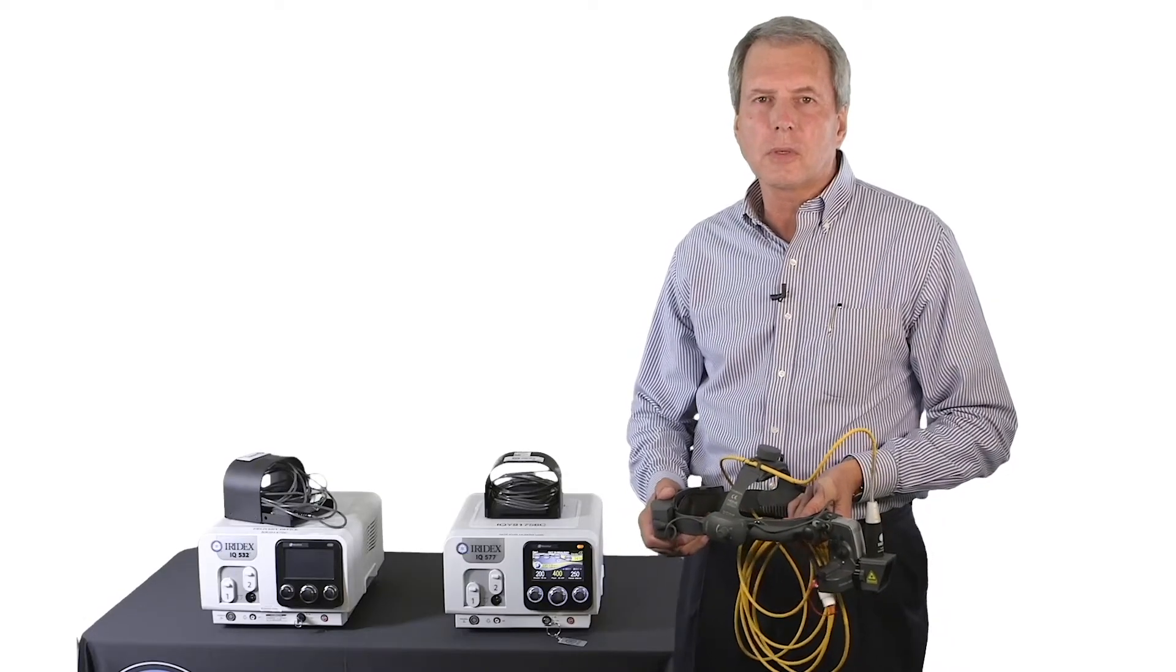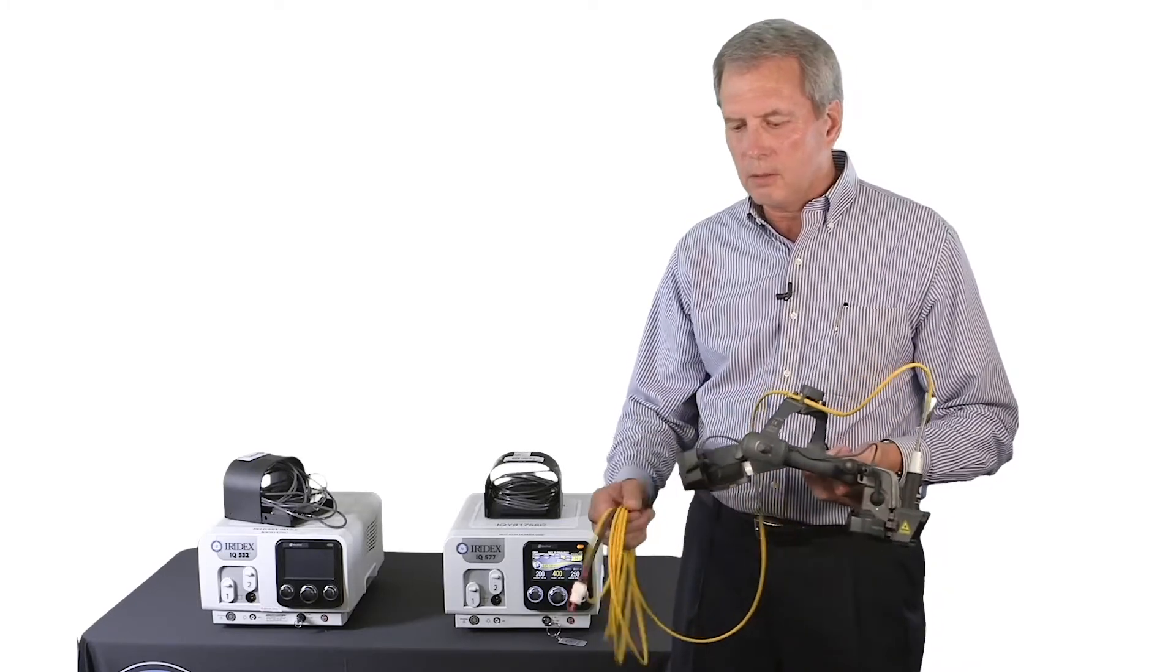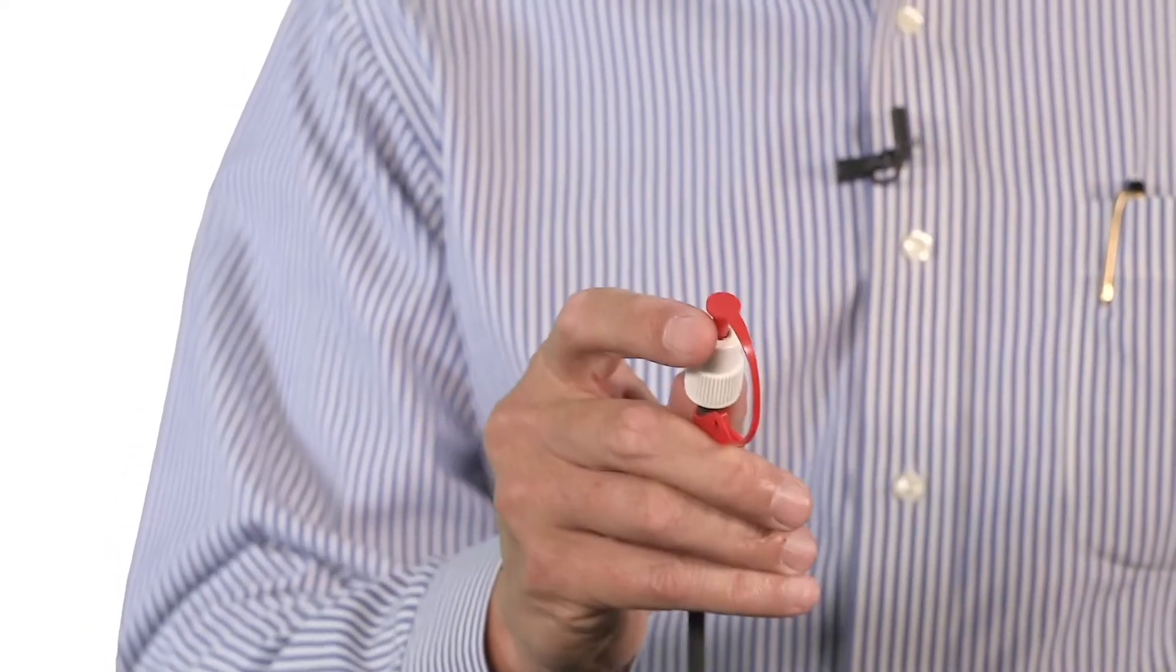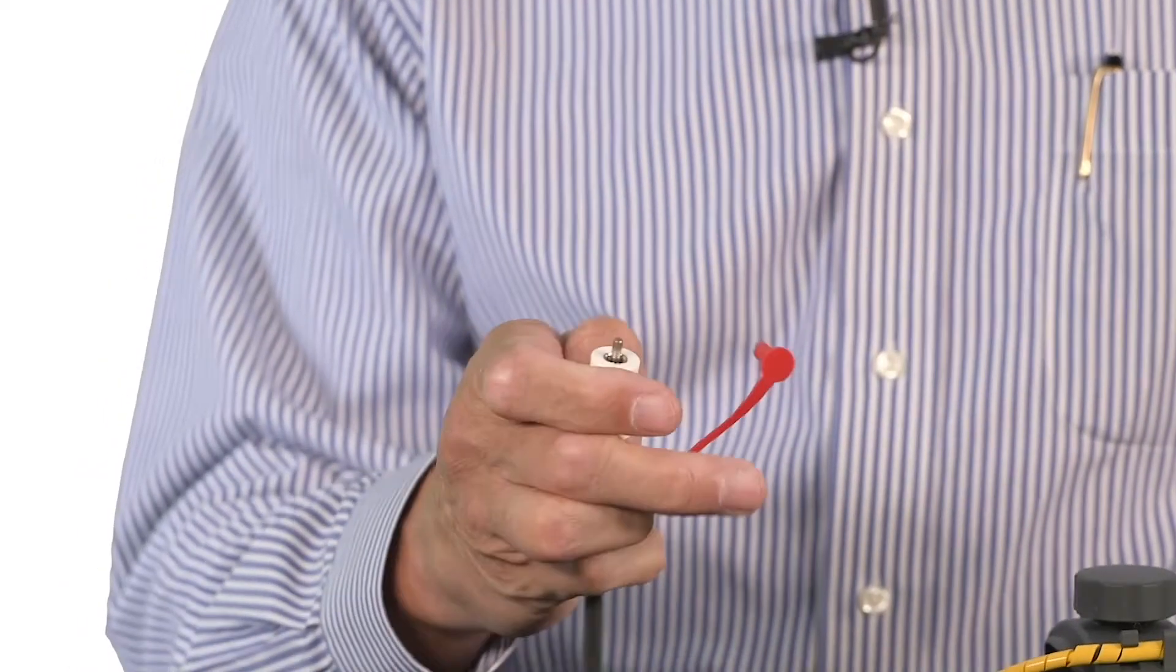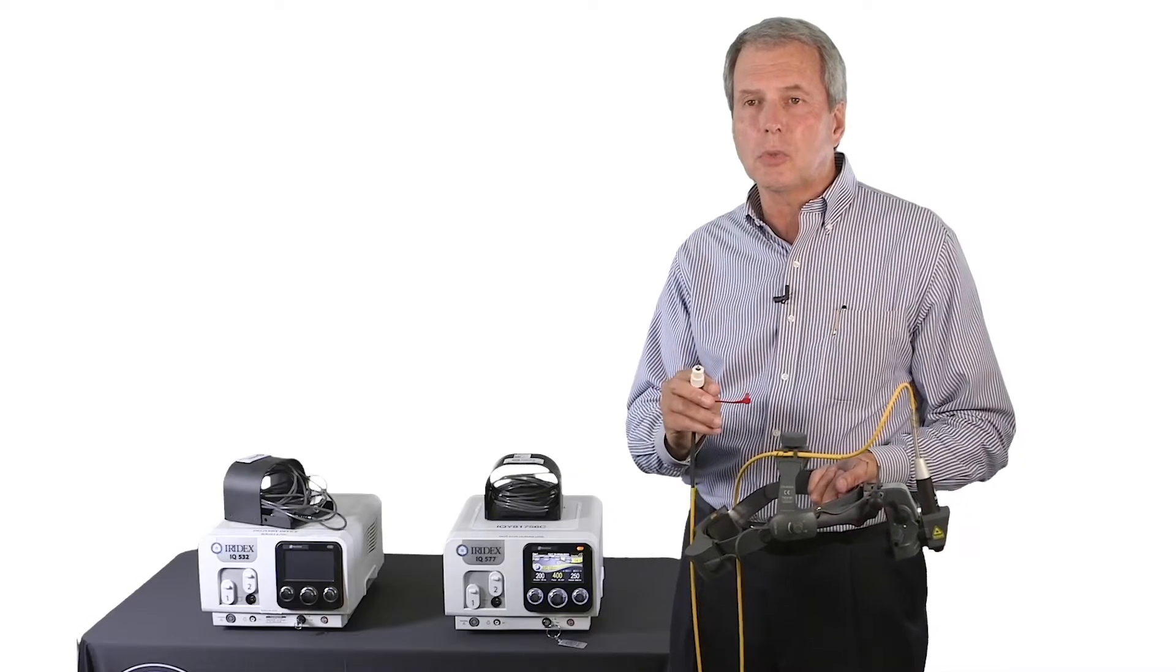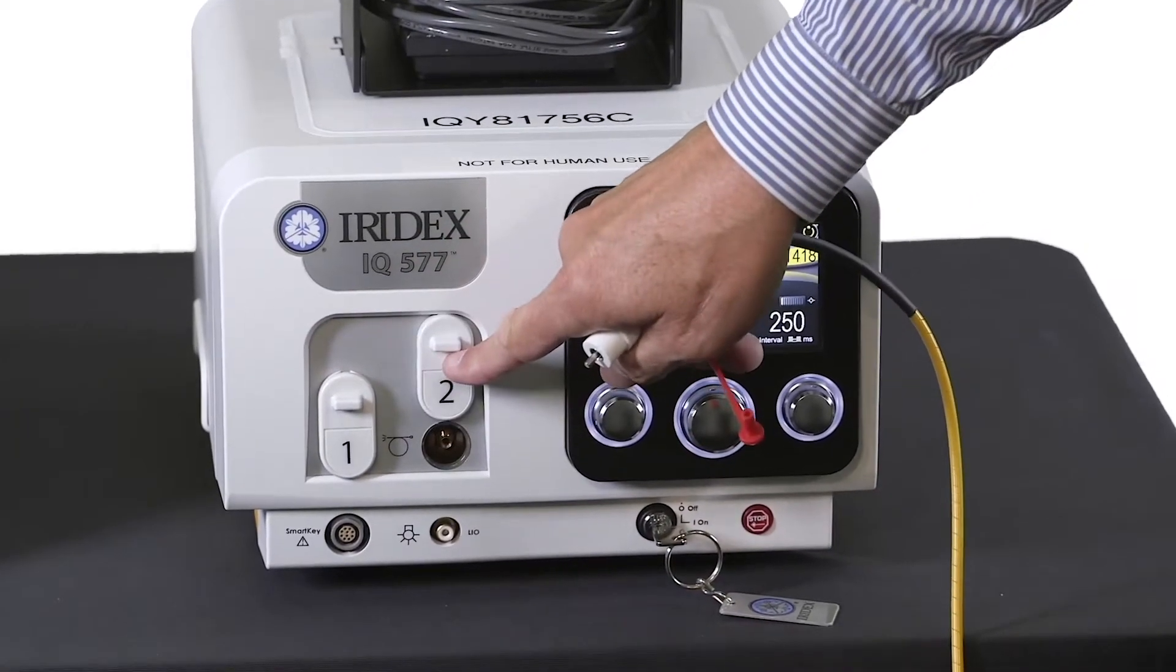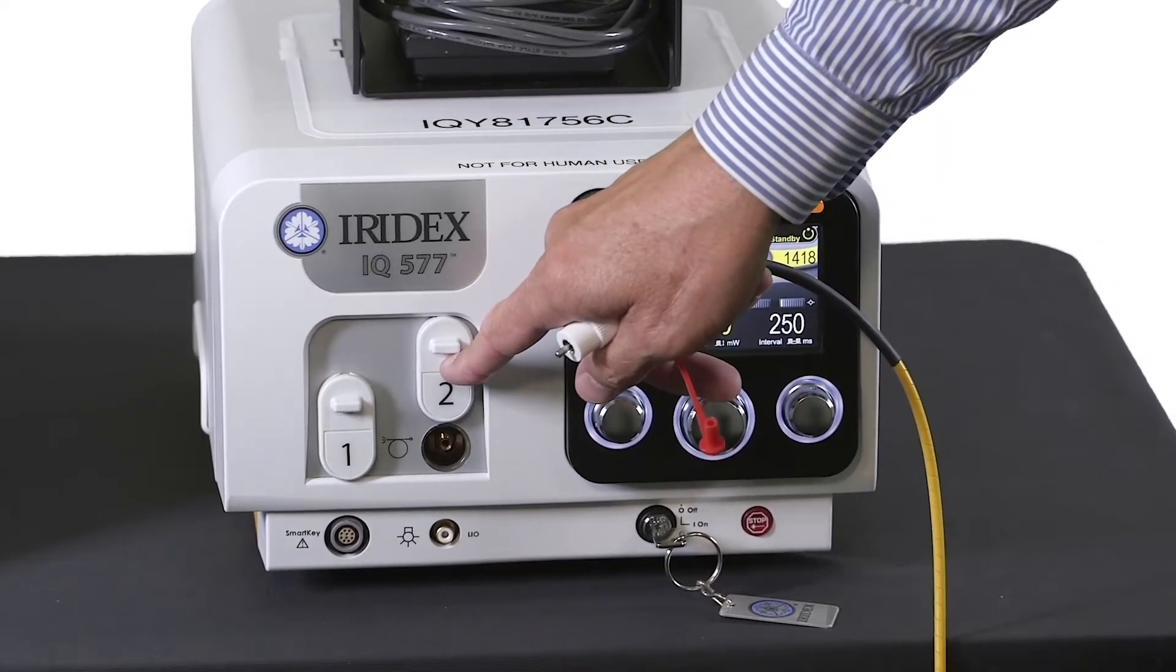In connecting your Iridex TrueFocus Laser Indirect Ophthalmoscope, you have a single fiber with a white RFID connector. The fiber should have the red protective cap on the end. Before you connect to the laser, you want to remove the dust cap and attach to typically the number two laser port. The laser ports are indicated number one, number two, and typically you'll attach the laser indirect ophthalmoscope to port number two.